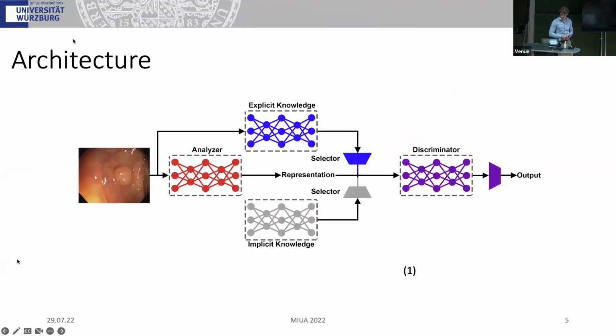So next, for the AI architecture, we used a YOLO-based architecture. So the original algorithm called You Only Look Once. And what's most important about these algorithms is that they are very, very fast. So you can actually get quite good results while being very fast. And if you're doing real-time applications, you always have to be very fast, because already minor changes in the delay from the endoscope to the view that the endoscopist has, you already see differences, and he will know that there's a delay in there.